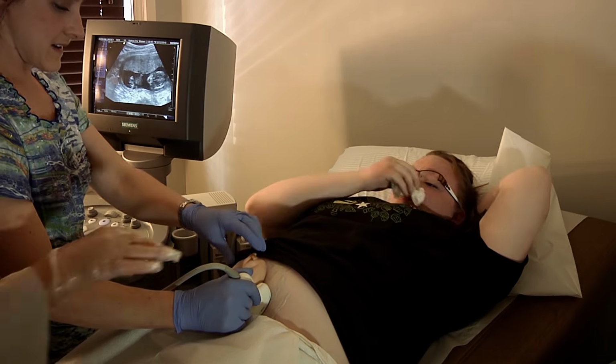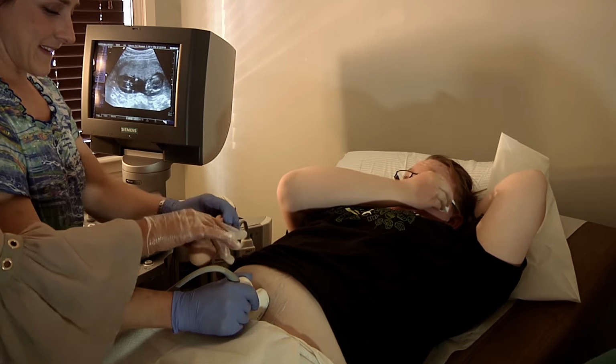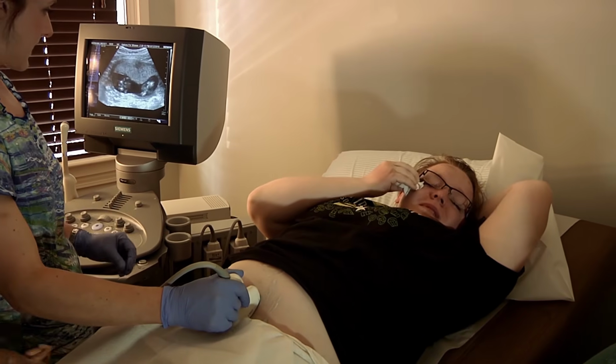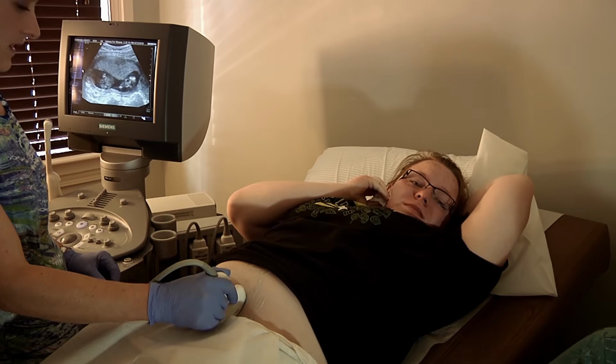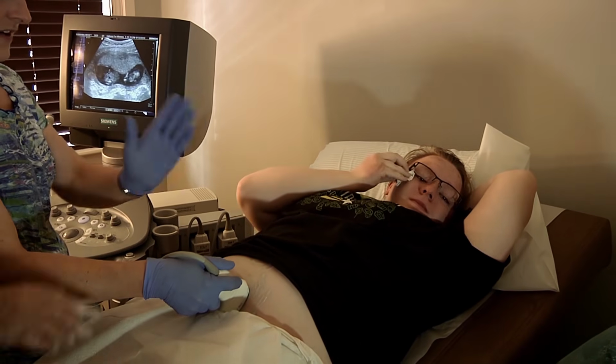Okay. At least I had some girls. I don't know for sure if it's a boy. I gotta peek yet. They want a boy, so that's fine. I don't care. Alright, so I go 90 degrees, and I can't go that way, correct? Correct. So I want to go this way, right.